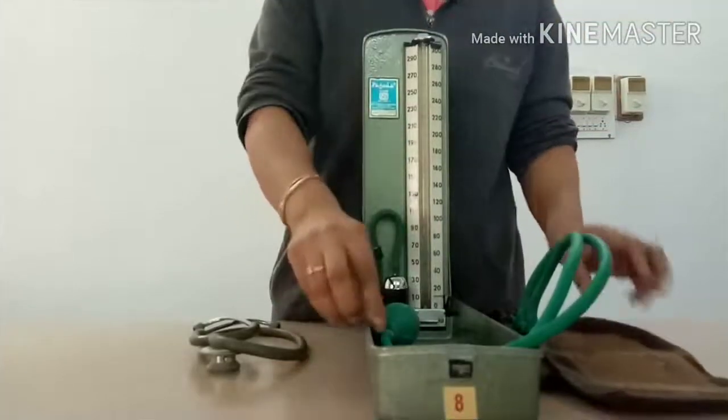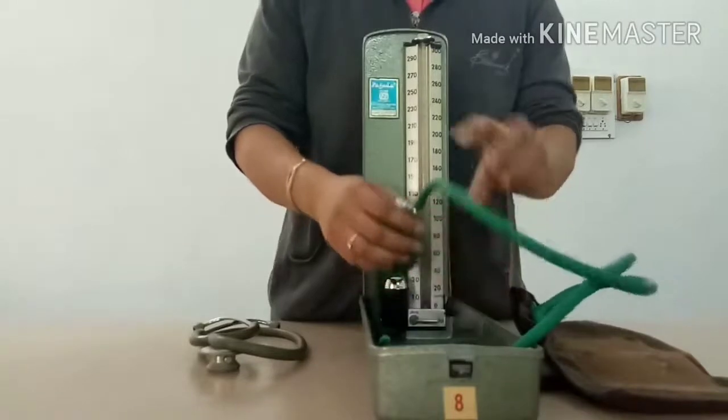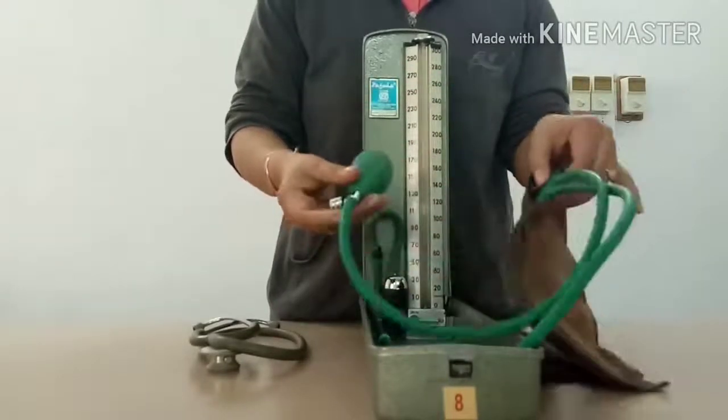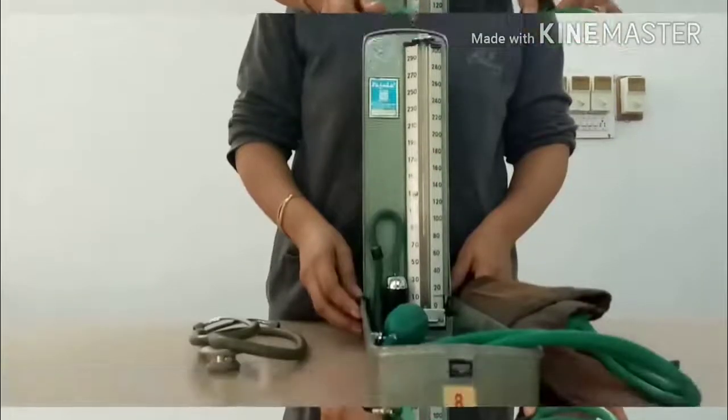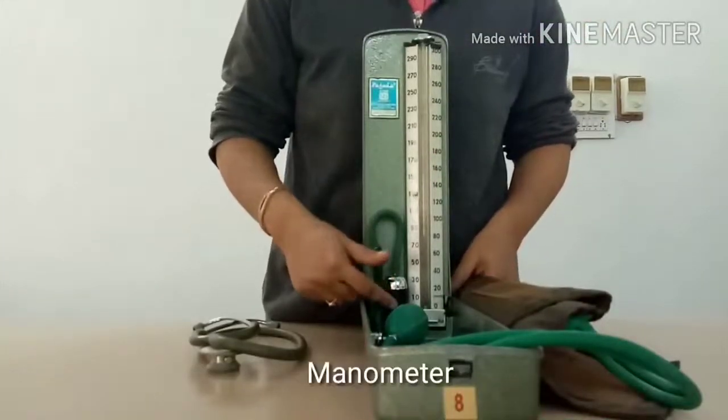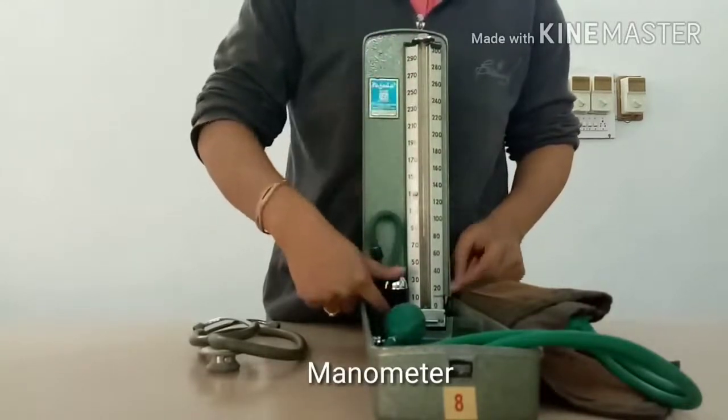A small valve is provided between the pump and the bag which permits the escape of air and reduction of the pressure when required. The manometer is a U-shaped tube, one limb being broader than the other.